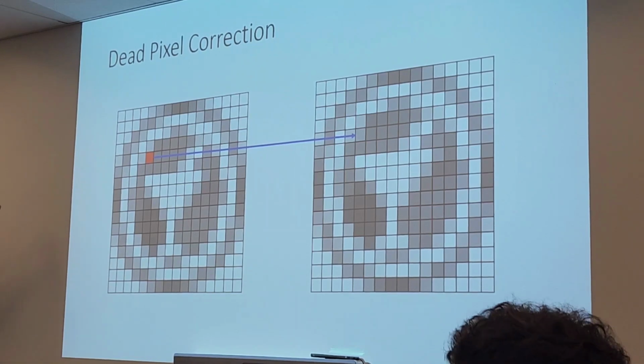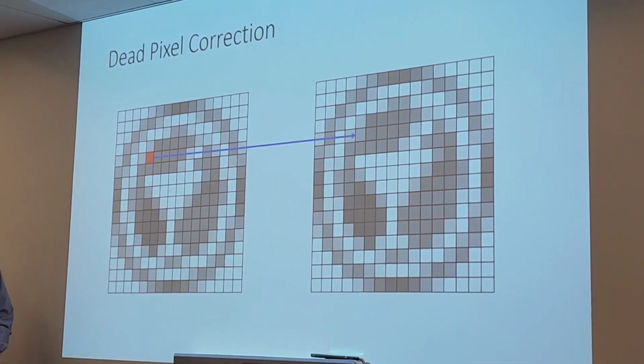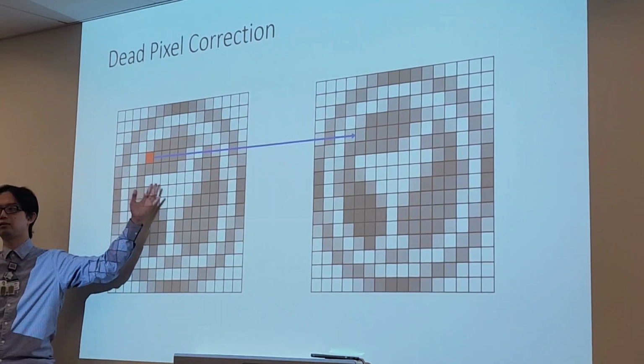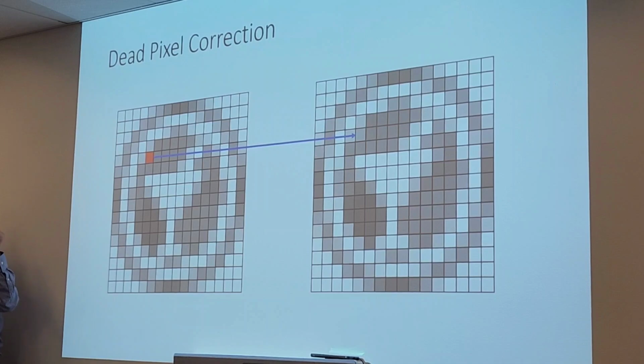All right, so dead pixel correction. Once again, this is pre-processing, right? This all happens behind the scenes before that image ever pops up.